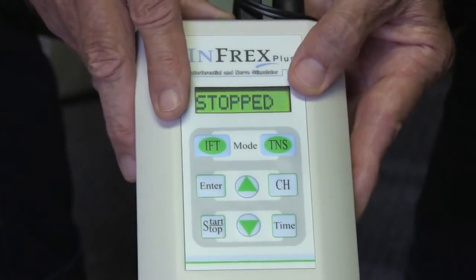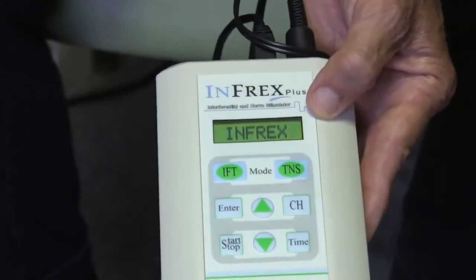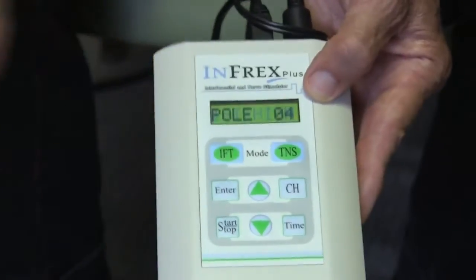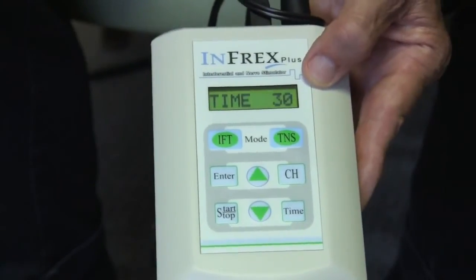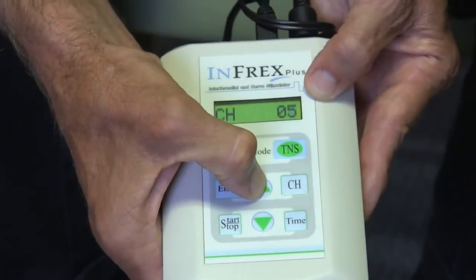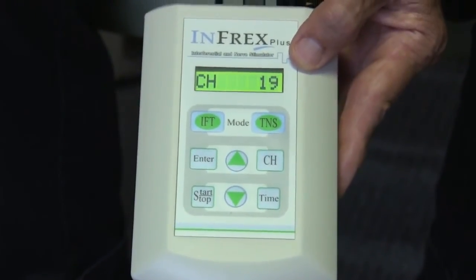Let's go through it one more time. Machine is off — turn it on with the toggle switch. You see MedFax, then Infrex. Choose: you want Interferential, not TENS. Hit IFT again for high and enter it. Pole four — enter. Time: 30 minutes — enter. Then hit start/stop. Now turn the power up by pushing the up arrow until you feel the sensation. The numbers aren't important — if it feels good, stop. The machine will run for 30 minutes delivering the stimulation.